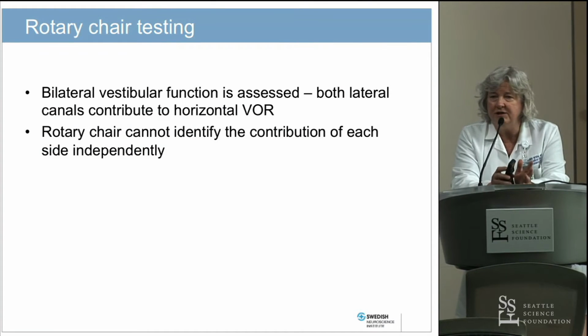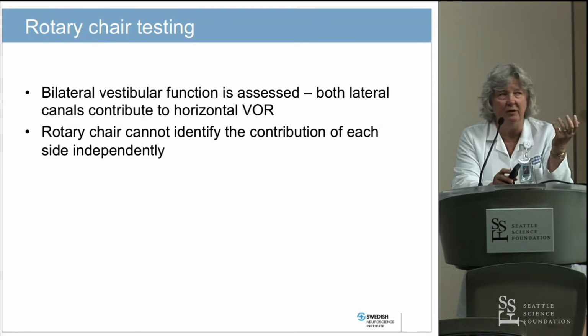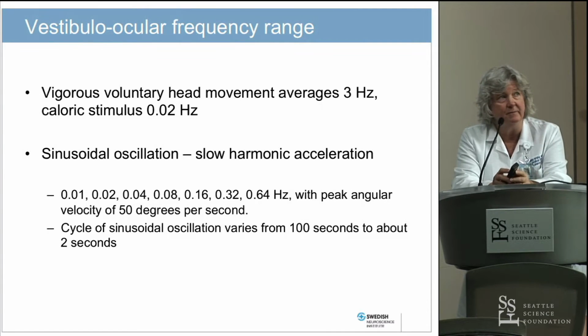So we can also assess maybe both ears are out. For some reason, maybe this is a patient who didn't have function on one side, you operated on the other, and we drop function in both sides.